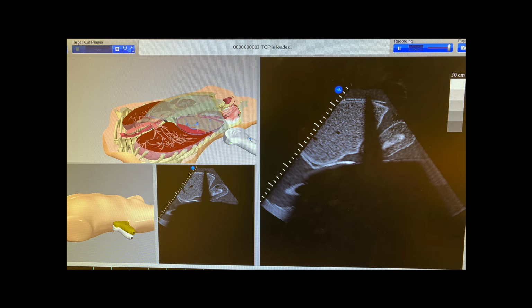Remember, the ultrasound beam is going to cut through the flank. So starting from the top of the screen down, everything against the probe itself is actually part of the flank. The ultrasound probe then images through the liver and kidney on the right side, or through the spleen and the kidney on the left side. Your diaphragm is going to attach back here posteriorly to the spine, and then it does sit up on top of the liver. But remember, the top of the liver is not where your probe is placed. Your probe is placed on the flank. The top of the liver is here.